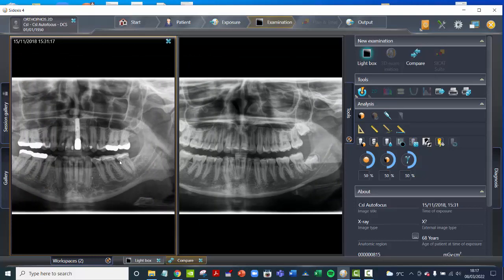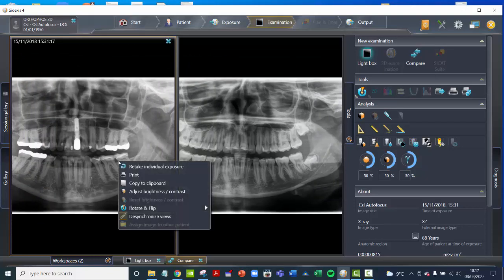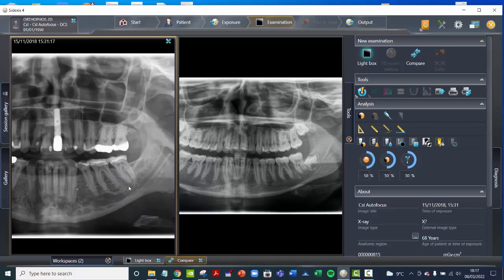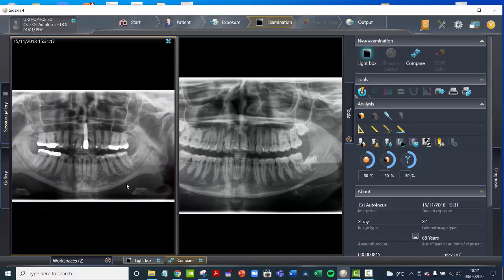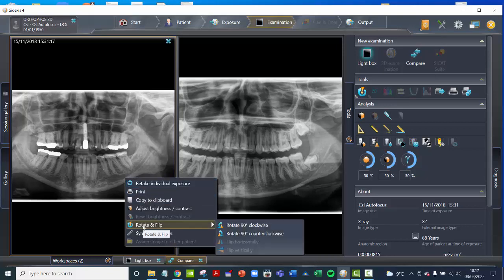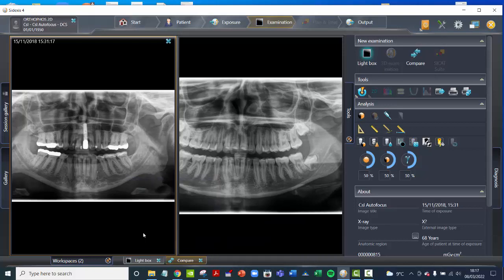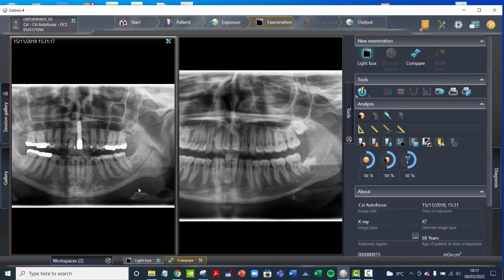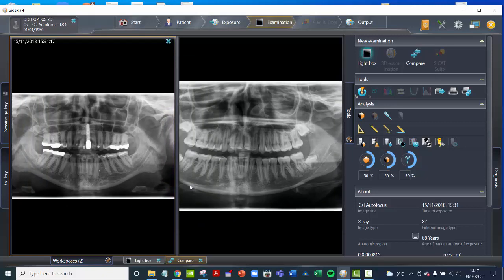If you don't want them both to move together, right-click and choose Desynchronize Views — now they'll be independent of each other. But most of the time you'll probably want to synchronize them so that you can see a before and after, maybe a year apart, something like that. Anyway, that's how you do it. I hope that helps.